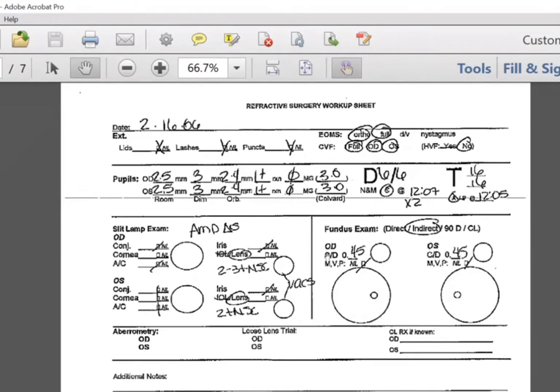CD represents the cup disc ratio. Sometimes they evaluate the size of the cup of the optic disc versus the actual disc to see what the ratio is. Usually if the ratio is very high, more than 1/3, there is a higher risk of this patient having glaucoma. So that's how the fundus exam is going to be useful.